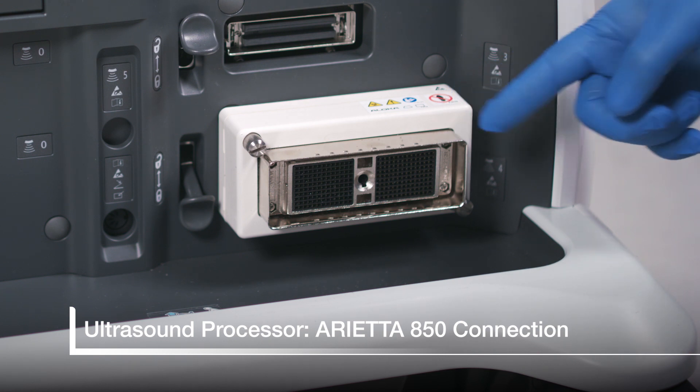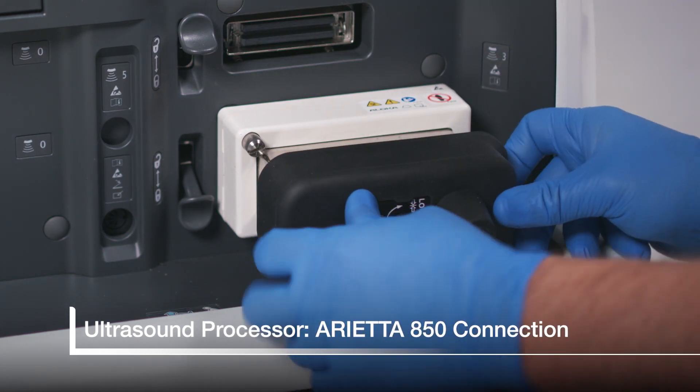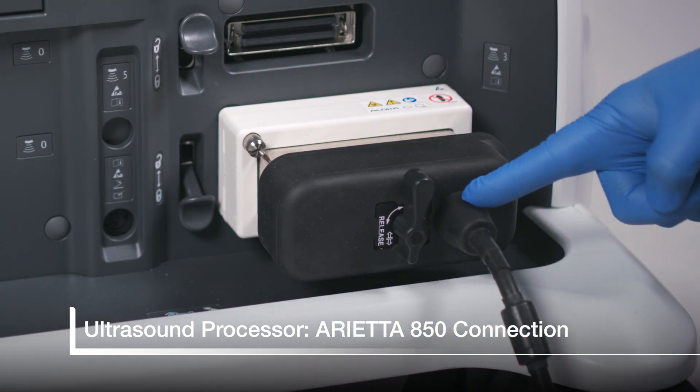The Arrieta 850 has a junction box to accommodate the current scopes. For the junction box connection, the cable will be to the right.